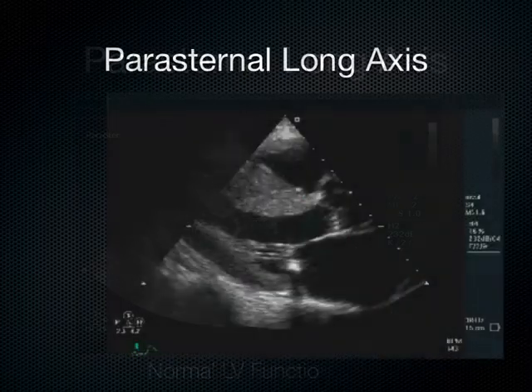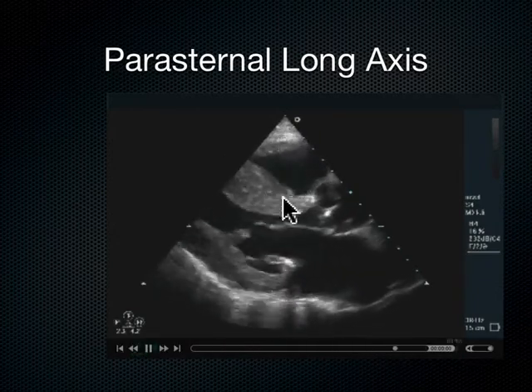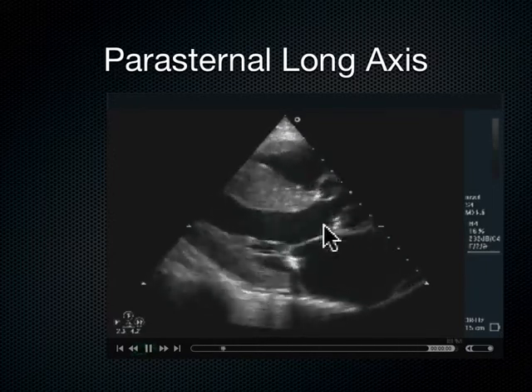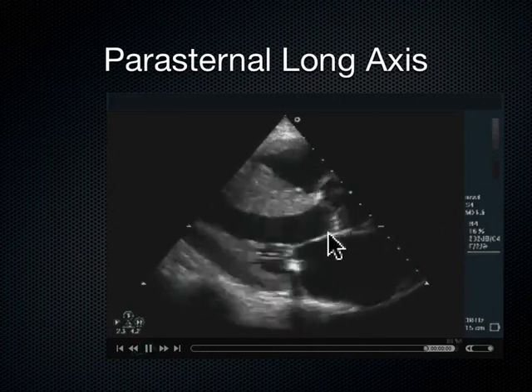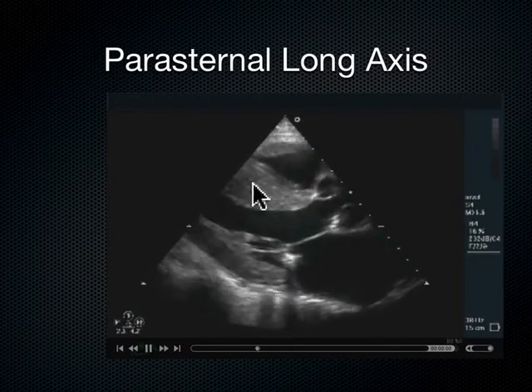Now let's look at another heart and do the same thing. How's that septal leaflet doing? Is it coming up and smacking the interventricular septum? You know what? It gets very close. It's got some good movement. I'm going to say yes. Okay? Is there sequentiality? You know, I don't think so. They seem to both kind of fire at the same time. So I don't see one then the other. Then I'm going to move on here.